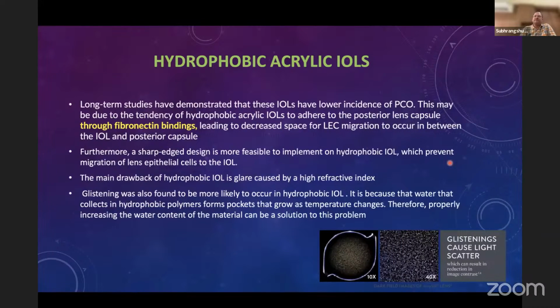Long-term studies have demonstrated that hydrophobic acrylic IOLs have lower incidences of PCO. This may be due to the tendency of hydrophobic acrylic IOLs to adhere to the posterior lens capsule through fibronectin bindings, leading to decreased space for lens epithelial cell migration to occur in between the IOL and the posterior capsule. Furthermore, a sharp edge design is more feasible to implement on hydrophobic IOLs.